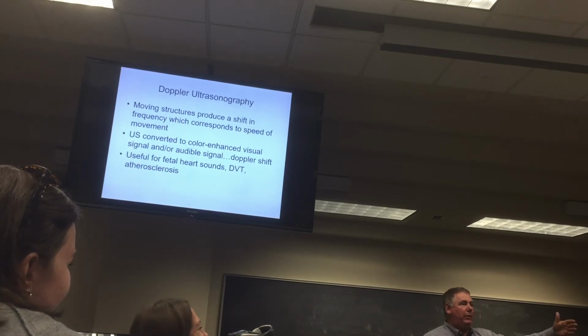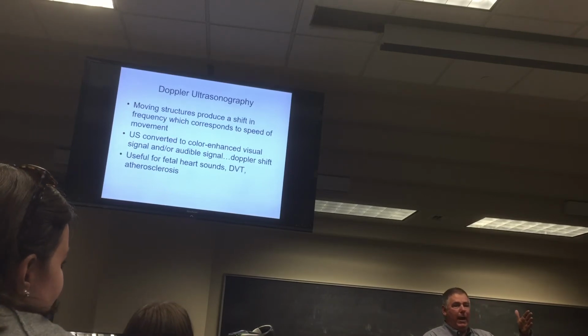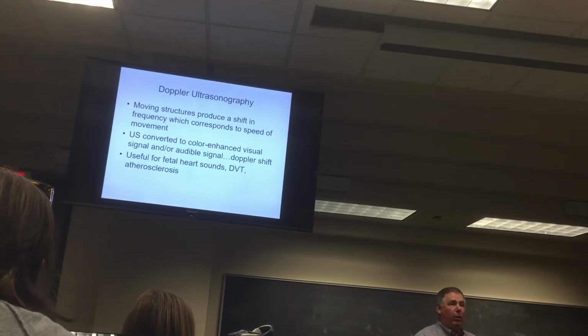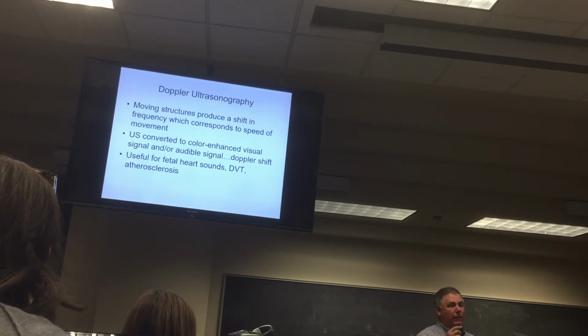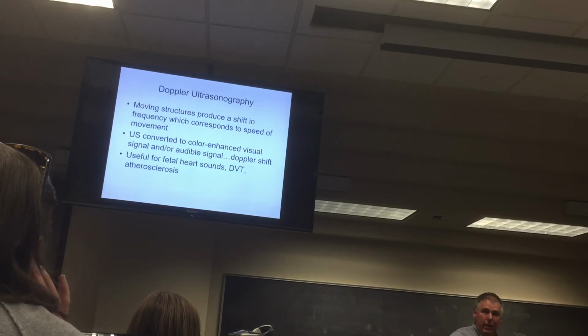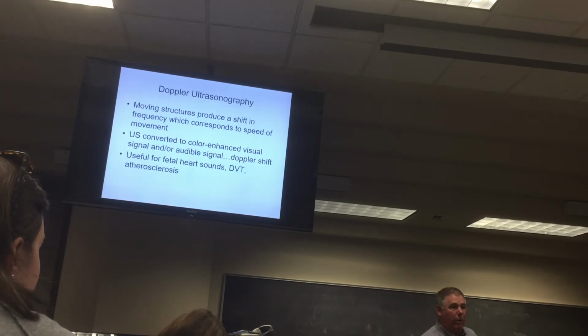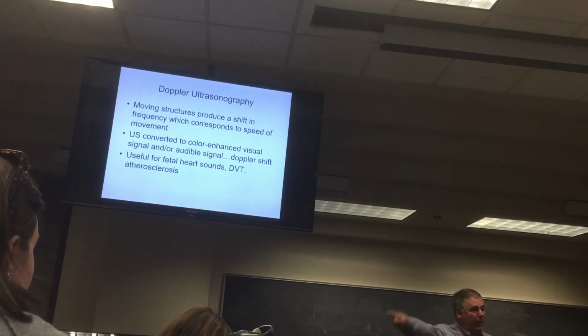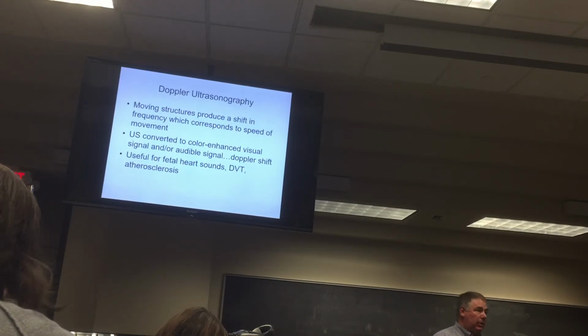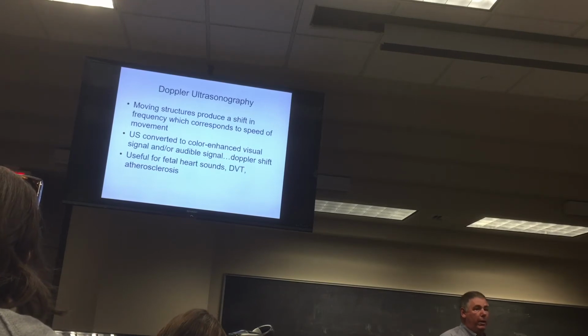as that train is coming towards you, it's compressing the air in front of it, and that's when you get the sound change. So that's the same principle that we have with Doppler ultrasound, and you're looking at the flow of fluid in vessels. The Doppler will even tell you if it's coming this way or going that way. And it will color things coming this way red, that way blue, or some derivation thereof. And that way it'll tell you there's an artery or vein, depending on where you are.